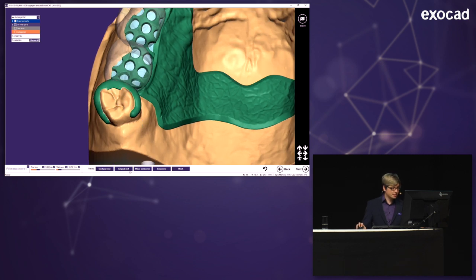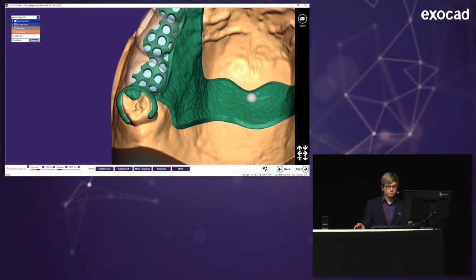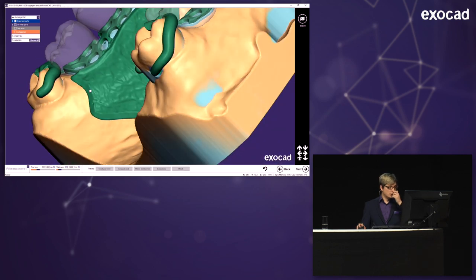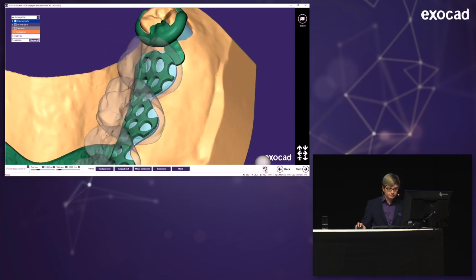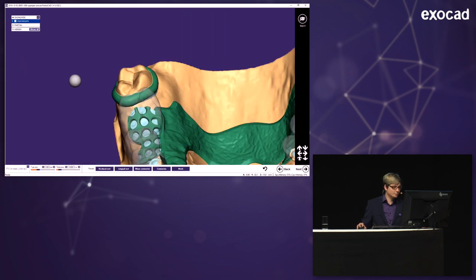And you have different presets here, like the occlusal rest. And you just use it. Click it and draw your occlusal rest just here. I'm doing the same on the other tooth. So I try to work always with the same kind of stuff I try to build. So first, I'm drawing all occlusal rests. Now I'm, oh, whatever did I do? I didn't really look what I was doing, to be honest. So now, yeah, well, this happens in designs. So just like that. Then again from here.